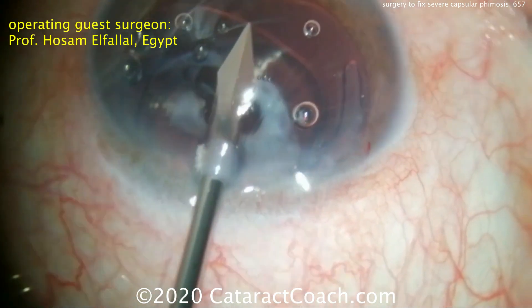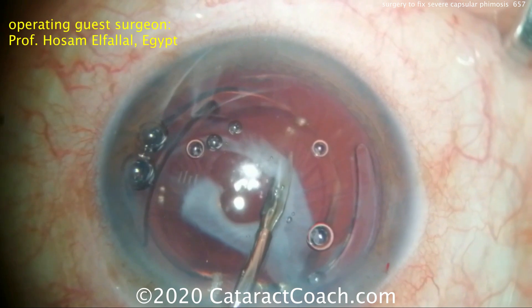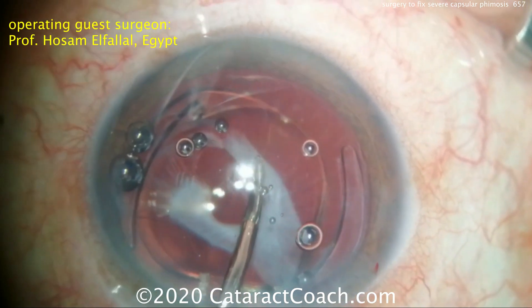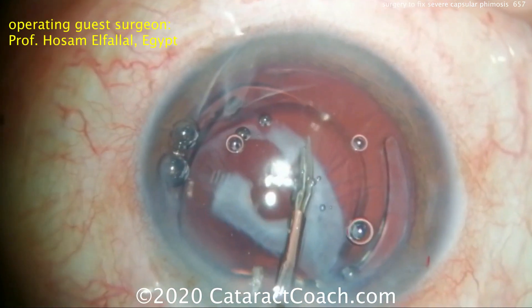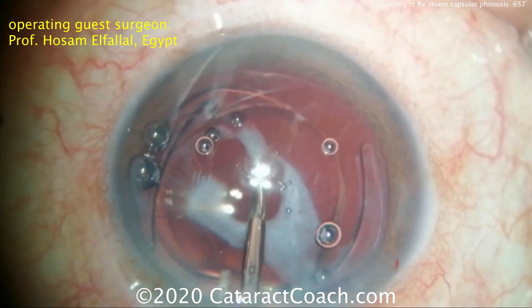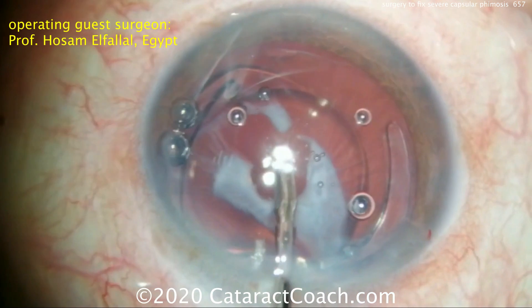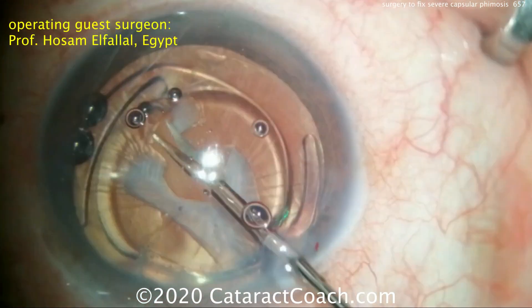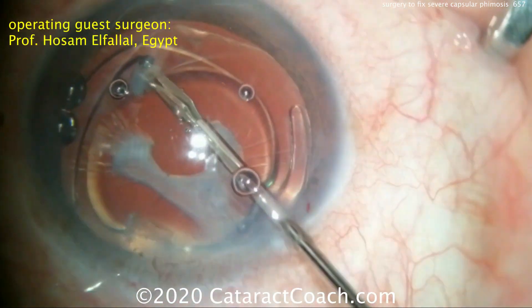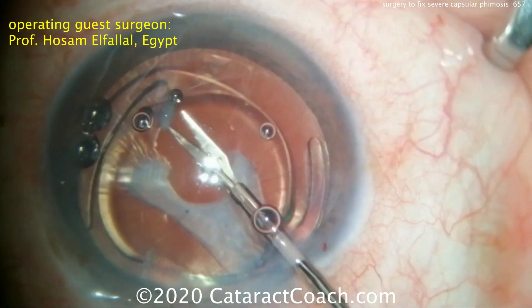Here's another paracentesis going into the eye. What are the causes of anterior capsular phimosis like this? Most commonly it's patients who have pseudoexfoliation or diseases such as retinitis pigmentosa — those commonly give this phimotic appearance to the anterior capsule. Remember, this started off as probably a 5mm capsular rhexis, but with the phimosis it ended up being about 1.5 or 2mm — a lot of contraction.